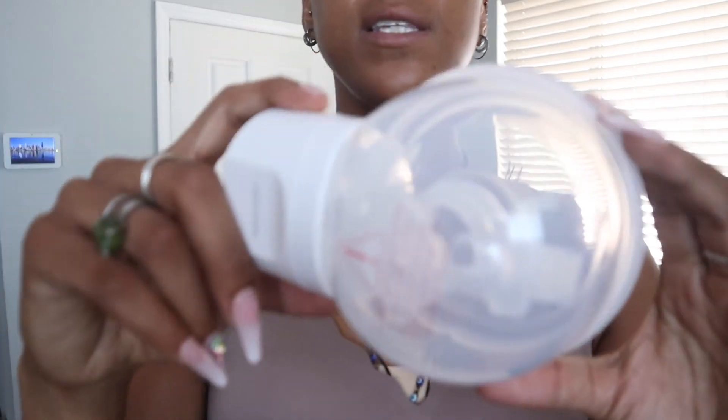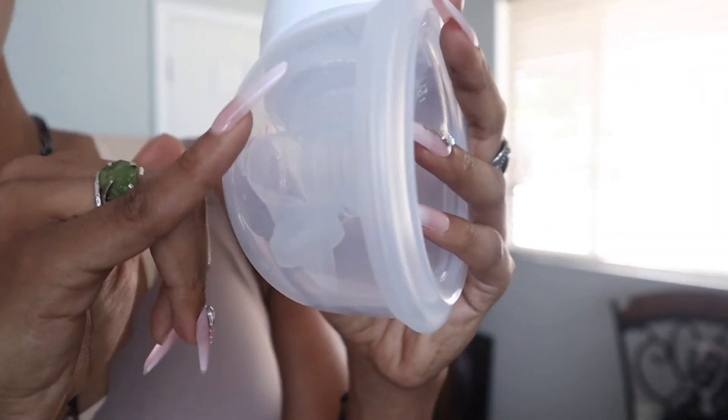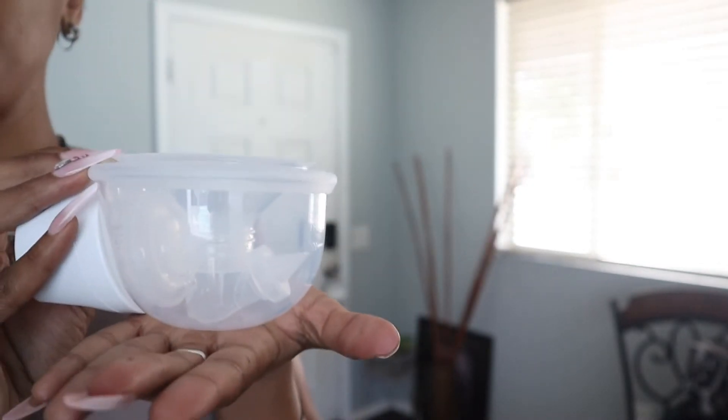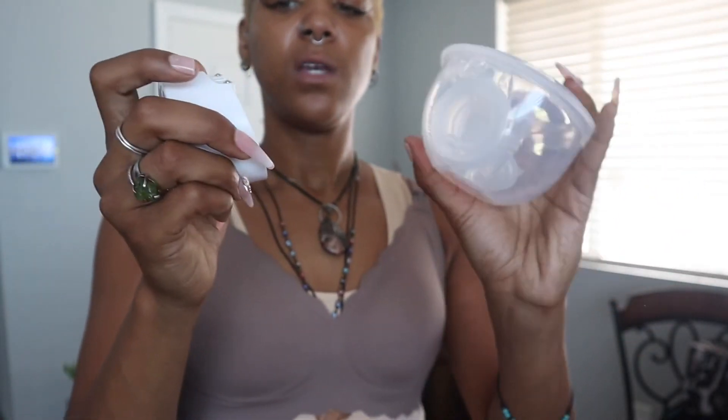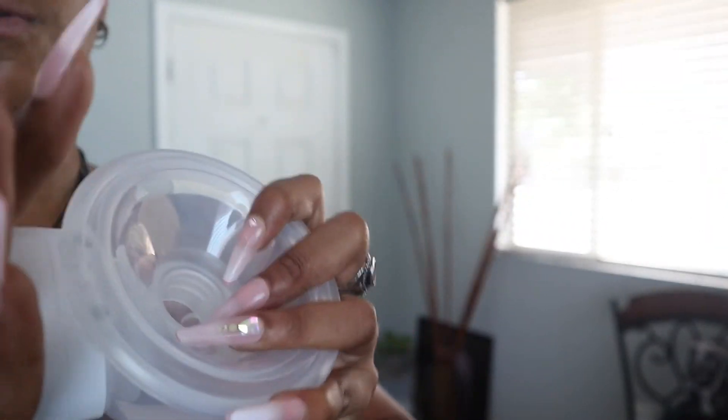They're not connected or anything like that, but it does fill to six ounces. You can have that right there on the side. You can also put the bowl like this. Really simple — this comes off really quick and easy. You can pop that off. This is super, super lightweight, guys. This can just stay right on here.